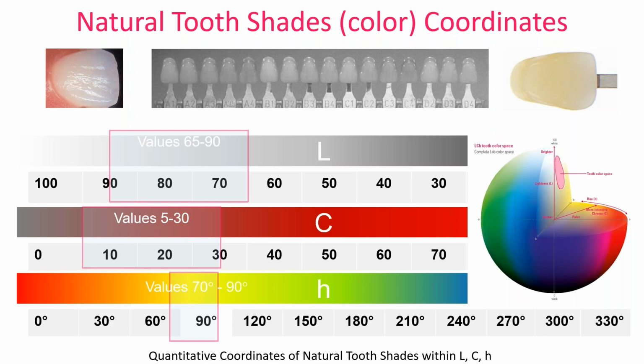We were able to quantify the classical shade system, identify each shade, and put it into the realm of the natural tooth shade area. As far as colors go, out of 14 plus million colors that are observable, the shades are really specifically in just one area of colors. Anything that falls outside of that, such as true bleach teeth, is not a natural tooth brightness. Those are usually changed or modified by using bleach materials and so forth.